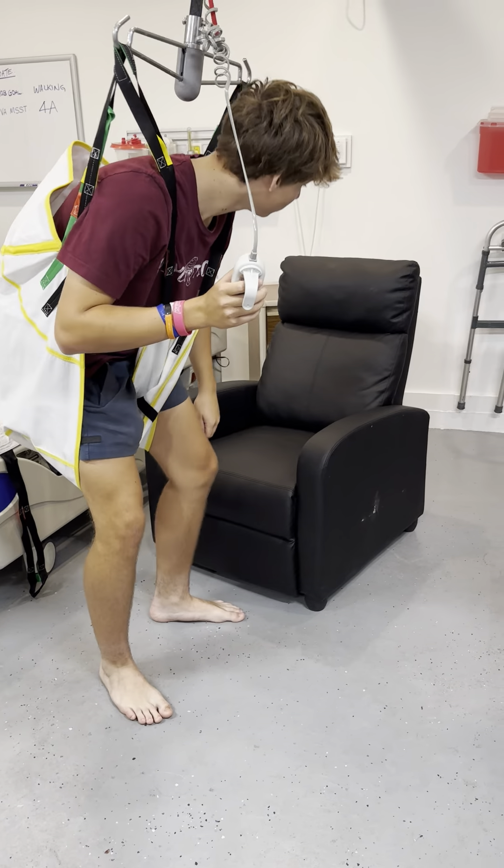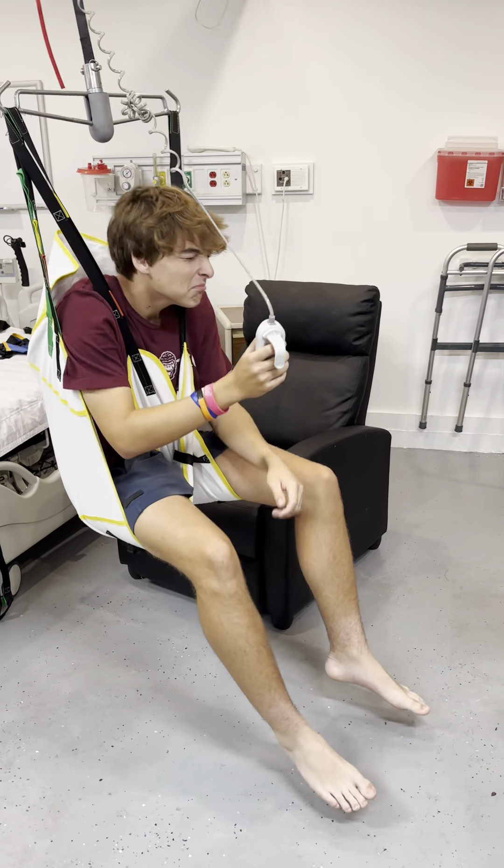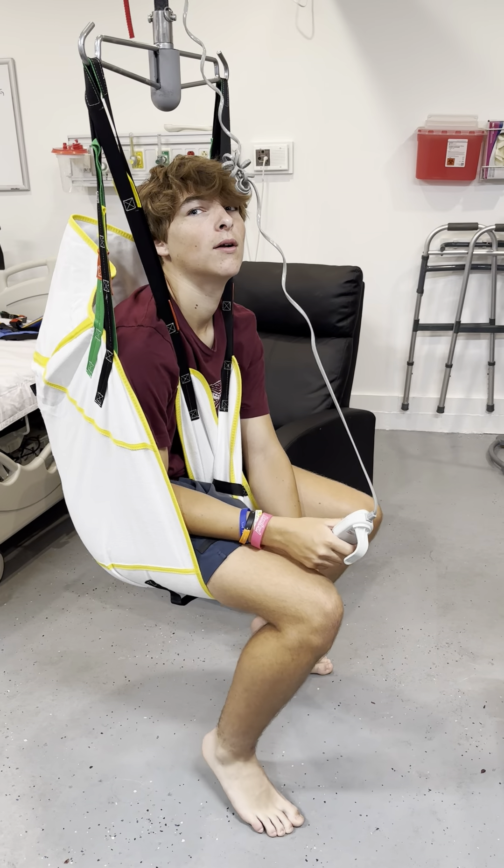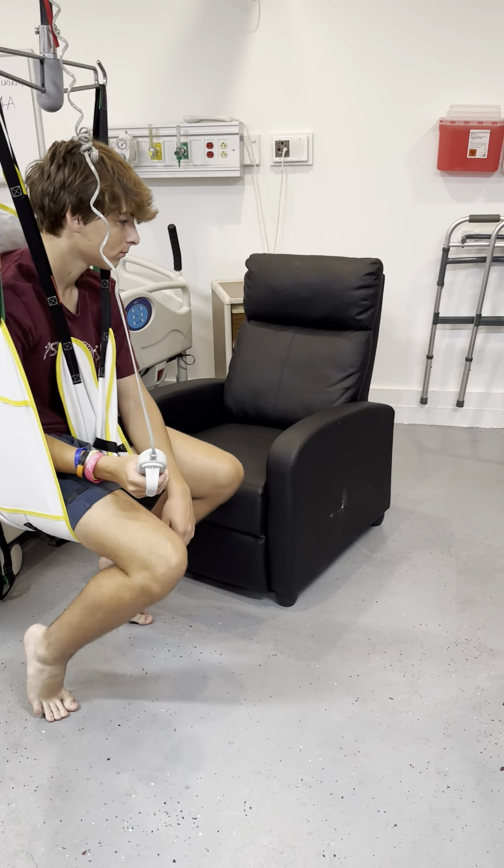Stand up and walk a little bit. How much weight can this hold? 600 pounds. Stand up one more time and sit yourself in the chair.